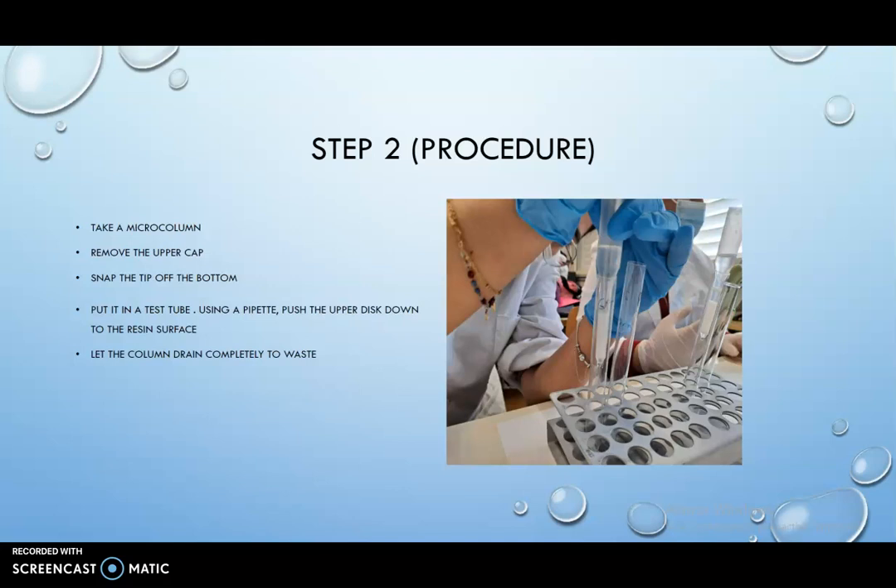Step 2: Take a microcolumn, remove the upper cap and snap the tip of the bottom. Put it in a test tube using a pipette. Push the upper disc down to the resin surface. Let the microcolumn drain completely to waste.